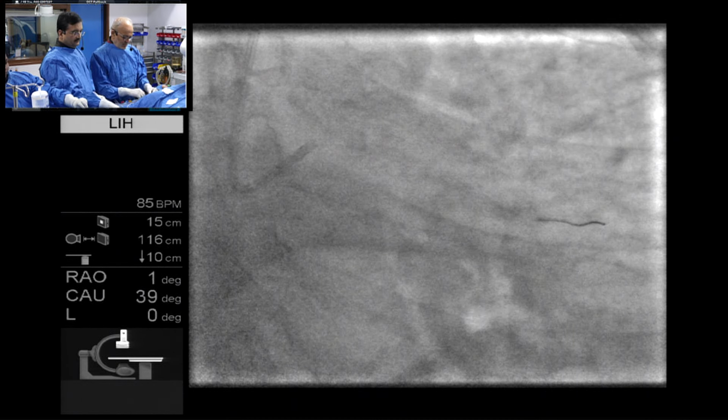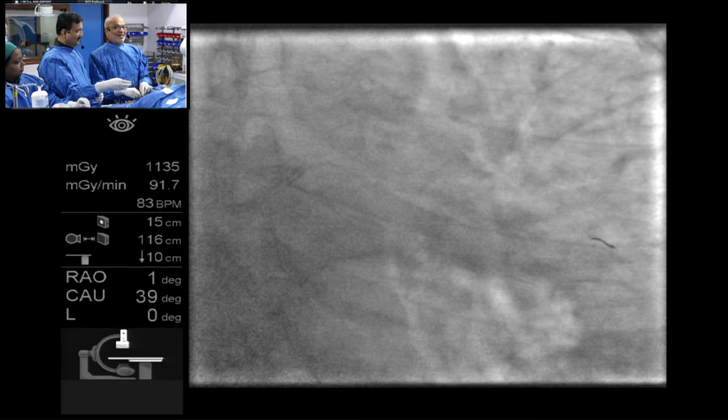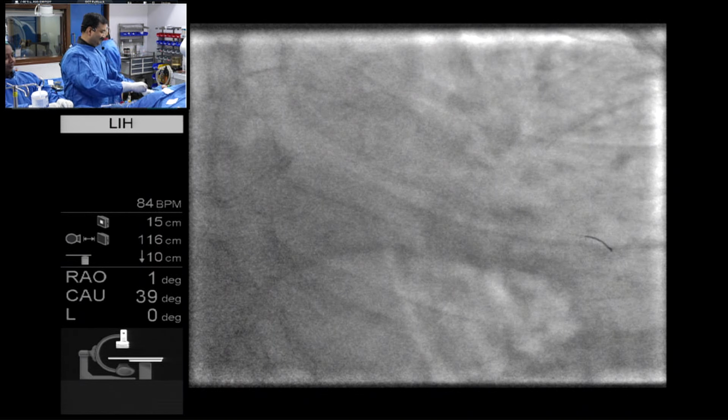I think you might want to give it the banana shape because it will fight you going in. Are there still young people sitting inside? Probably, yes, I'm sure. Then we can show that, making the balloon steerable, right? Yeah. We can show that. Banana shape.